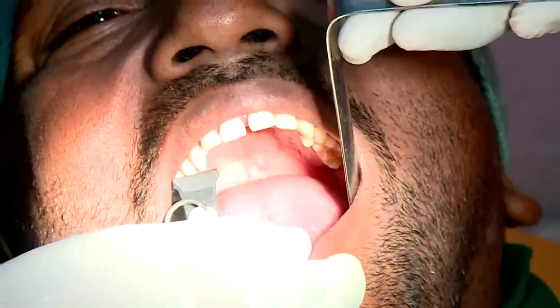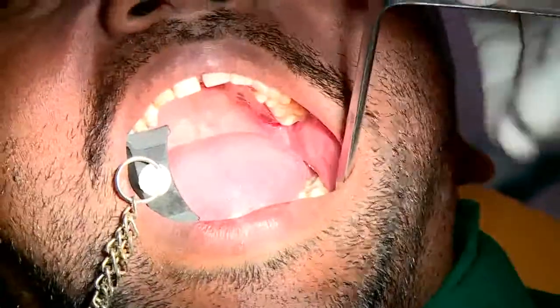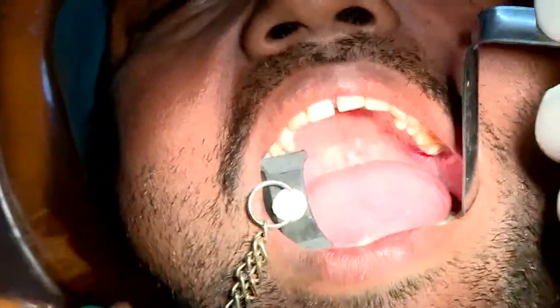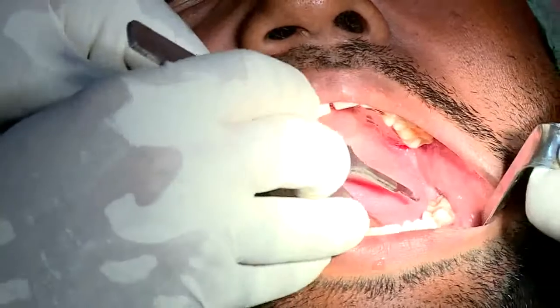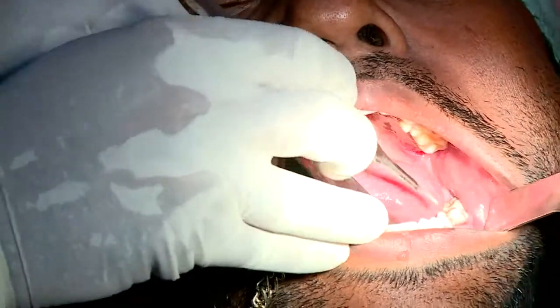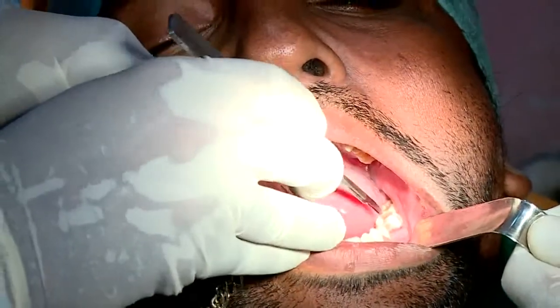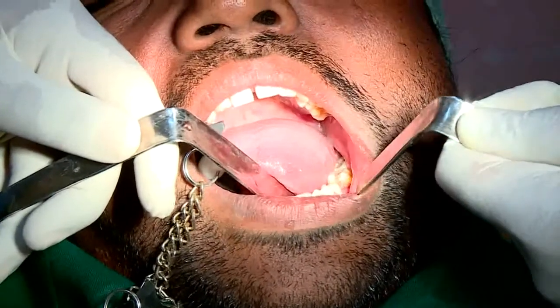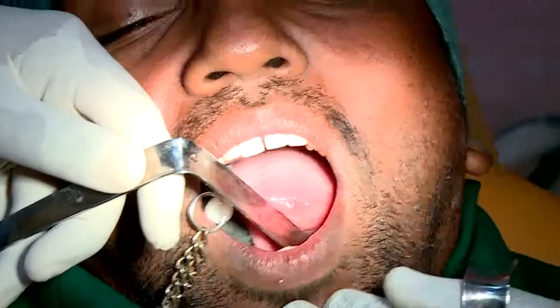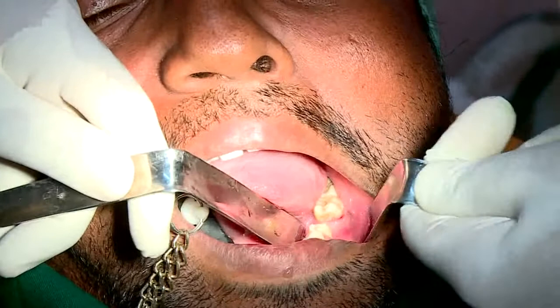Another Austin retractor, so that we can retract better. Okay, so now for this patient, I am actually going to do a standard crestal incision, which means I am not going to make a relief. So, a doubt here. Yeah. Are you going to make just a crestal incision or an off-crestal? Nowadays, people are moving toward off-crestal. Can we throw some light on that?